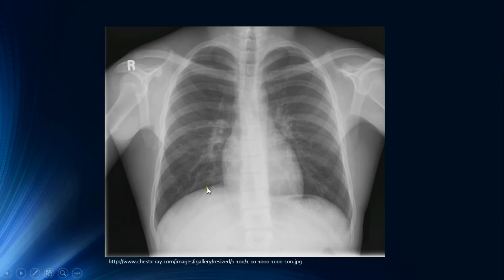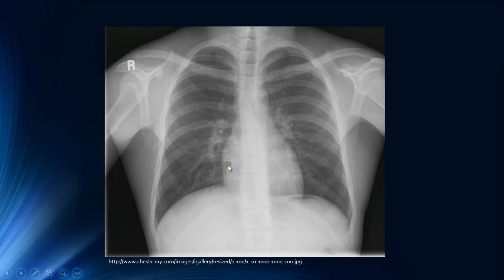We also look at the retrocardiac shadow — the lung fields behind the heart — as lesions can hide there. And we check the lung fields under the diaphragms. Moving to C — cardiac and mediastinum: cardiomegaly is defined as the maximal transverse cardiac diameter being greater than 50% of the maximal internal transverse thoracic diameter. We simply measure the longest transverse cardiac diameter and confirm it is less than 50% of the thoracic diameter.